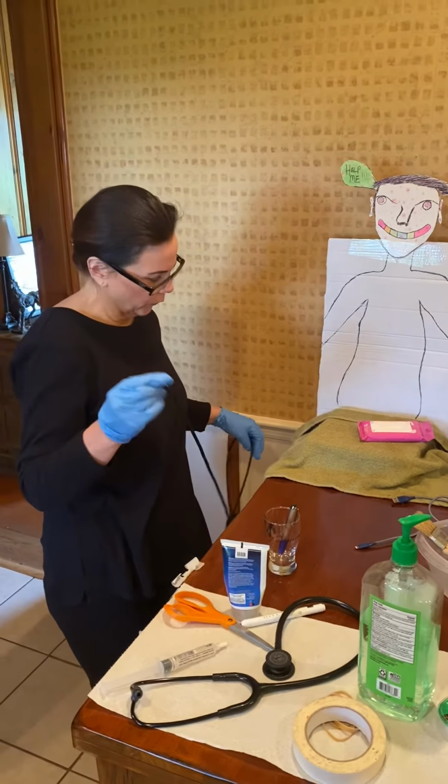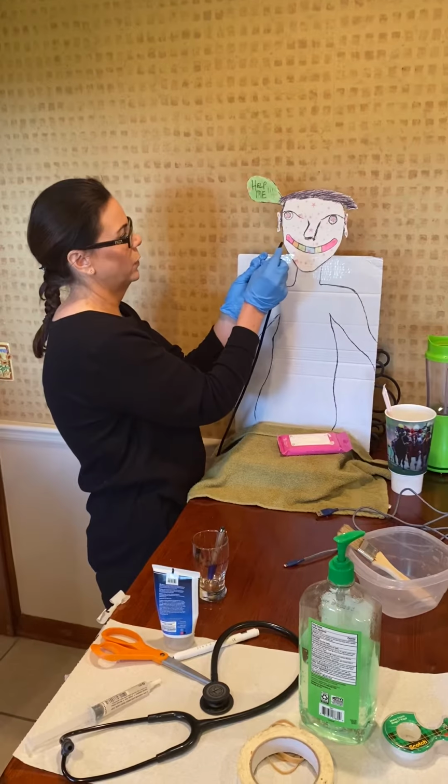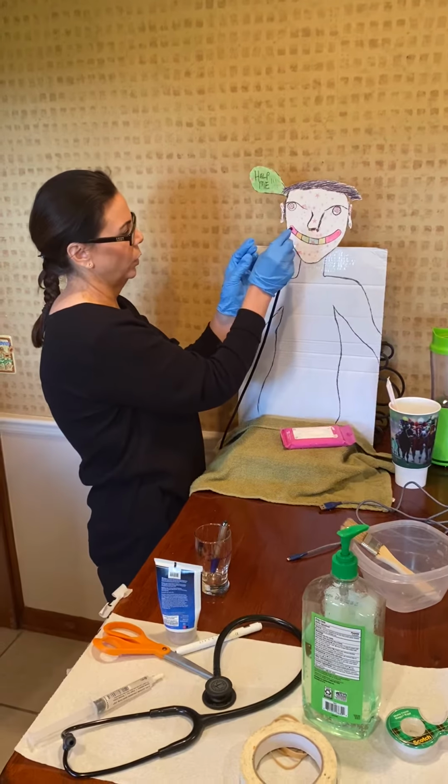In the high Fowler's position, Mr. Smith, I'm gonna ask you to tilt your head back, rest it against the pillow, and I'm gonna insert this NG tube down your nose a couple inches to the back of your throat. So, I'm inserting, good. I'm now gonna bring his head forward, and every time I push this tube down 1 to 2 inches, he's going to swallow. So swallow, swallow, swallow.